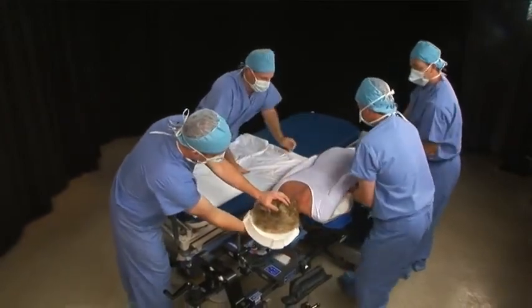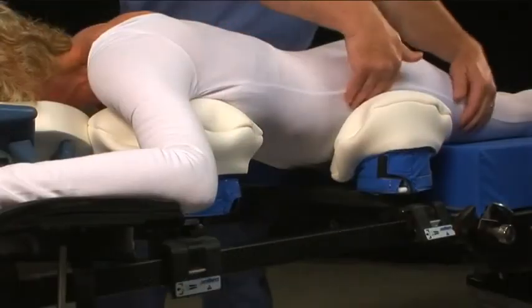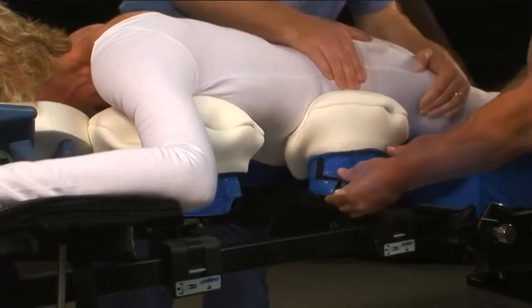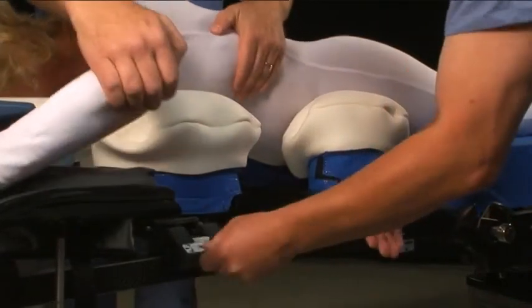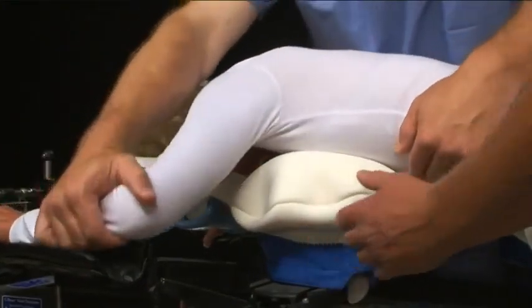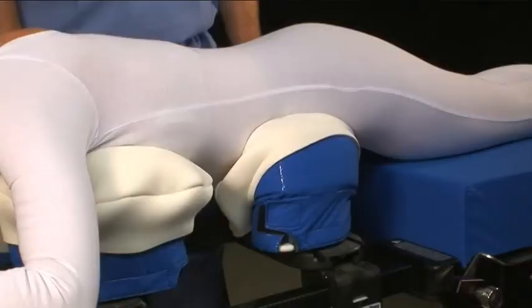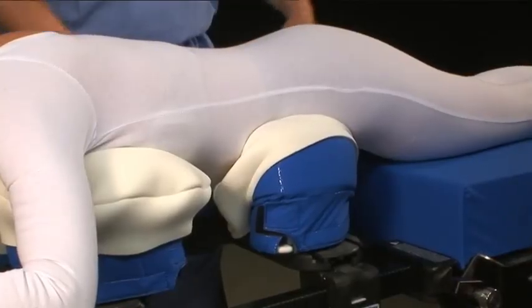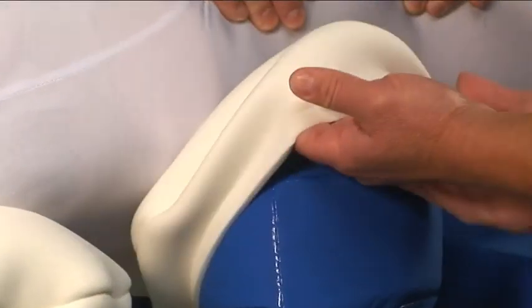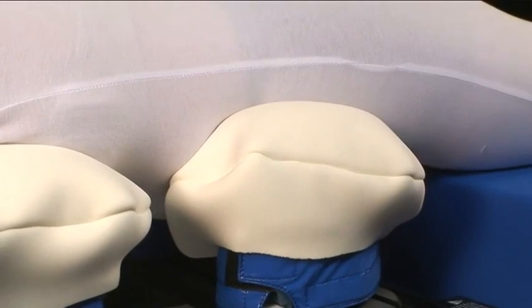Readjust the Wingsets to contour to the patient's anatomy. Make sure that the bony protrusions at the hips are centered on the hip pads. With male patients, center the nipples on the chest pads. With female patients, push the breast down into the abdominal area, or remove the center pad on the chest Wingset and push the breast in. Make sure that the abdomen is free from pressure. Adjust the comfort covers so that the patient is not lying on a seam — roll the patient's hip back and pull on the cover, holding above the seam so that you are pulling both the foam and Tyvek layer to ensure that the cover does not rip. Repeat this for all four sides.